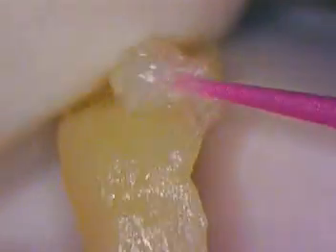Okay, we got it on a micro brush, and we're just going to go on the outside, not the inside, but the outside of our tooth, ever so gently. I might even change gloves after putting this separator on. All right, so let me change my gloves. I got the separator on there, and now we've got a mix for the delivery, and Dycal, just one drop of each. I mix it together and in it goes. It's very fast. And the patient bites down on some cotton just to seat it.